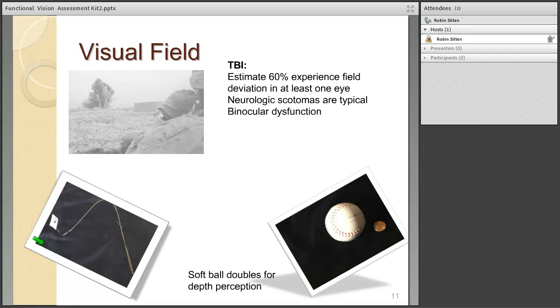In the lower left, right here, is the visual field testing wand I made for our early lab activity. It's just a playing card on a wire hanger. My preferred tool here would be something along the lines of a cat toy, the kind that's a fishing rod type wand with a fixation object attached. The wire hanger does pack well, though, and it's durable for what it needs to do.